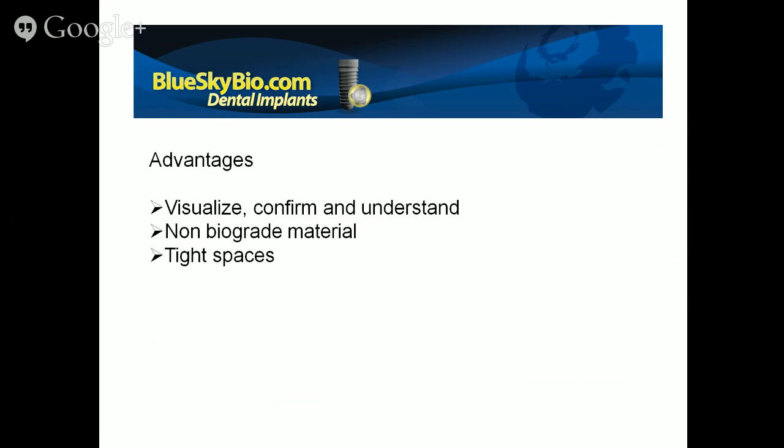So it's a good option for in-house surgical guide fabrication, whether you're a dentist or whether you're a lab. If you want, you could get a relatively cheap 3D printer for a few $1,000s, print your own models and posts, and make your own surgical guides that way.